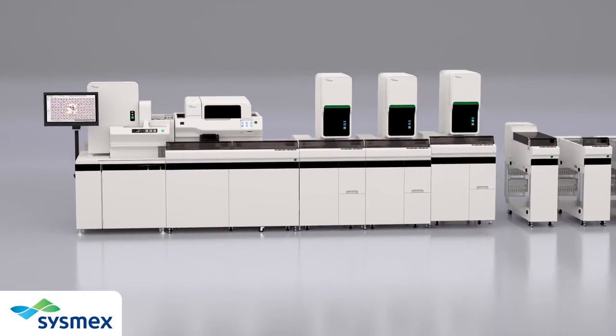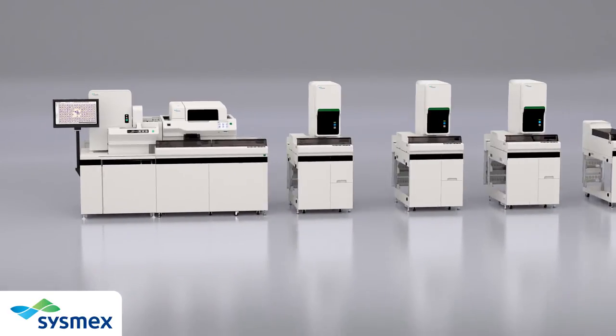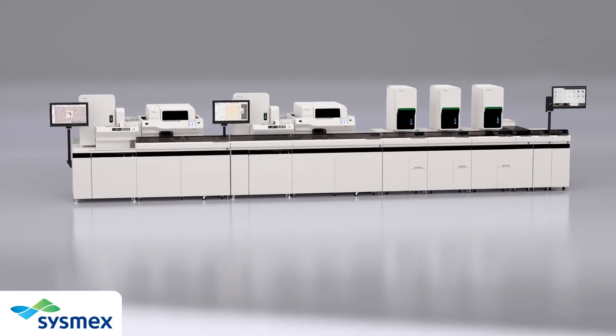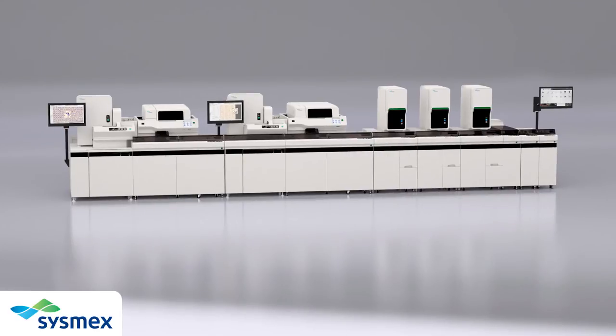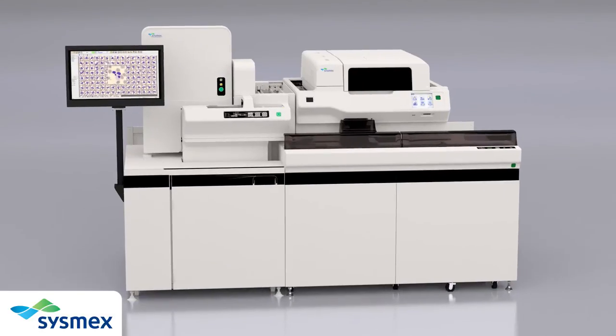The XN configurations allow customers to experience hands-free sample processing within the hematology work cell. The DI60 is also available as a standalone work cell connected to the Sysmex SP10 Automated Slide Maker Stainer.